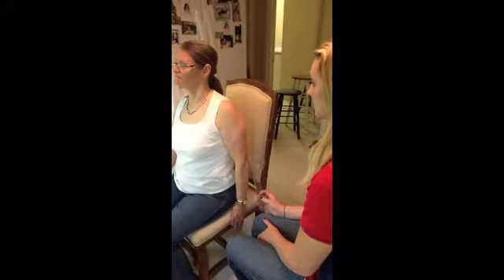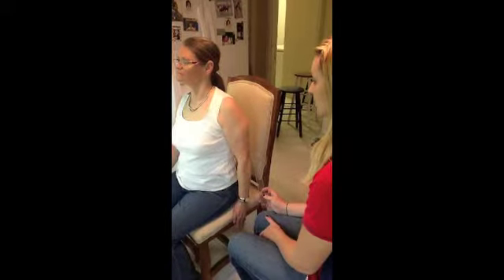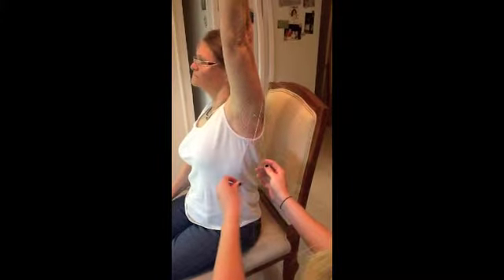For shoulder flexion, the subject is seated with the humerus in neutral position. The axis of the goniometer is centered on the humerus just distal to the acromion process on the lateral aspect of the humerus. The stationary bar and the movable bar are parallel to the trunk. The client's arm is raised in front of her body in a sagittal plane of movement. The measurement begins at 0 degrees and ranges to 170 degrees.